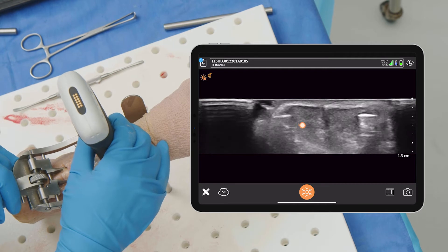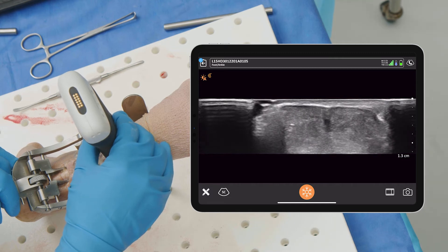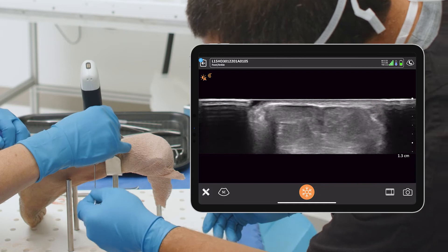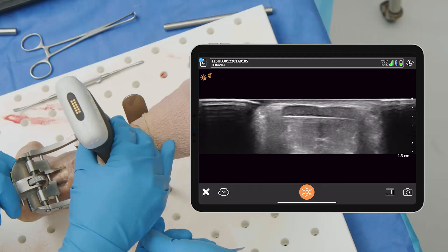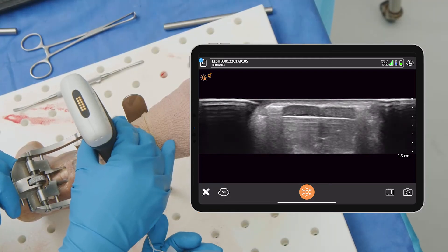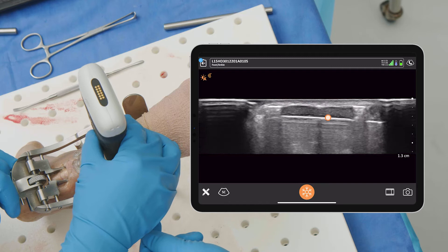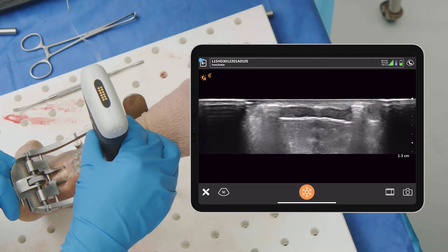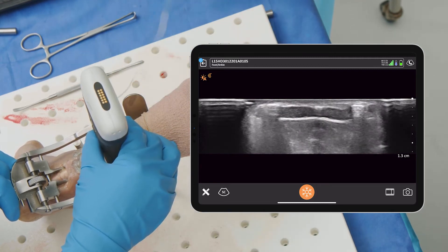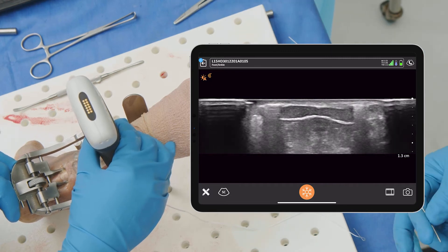We can see our Achilles really well right there. We can see the metal pieces — go ahead and fire across the first one. You can see it really nicely, and in this case we are pretty much right in the middle of that tendon. That looks really good. We can go all the way through and pass the wire. You can see the suture sliding back and forth — we're nicely in the middle of that tendon. Let's go and do number two.